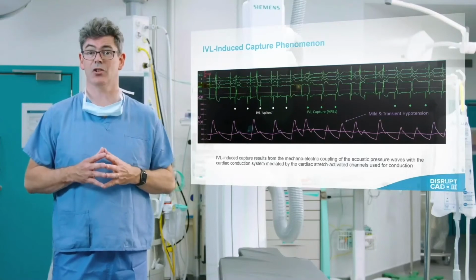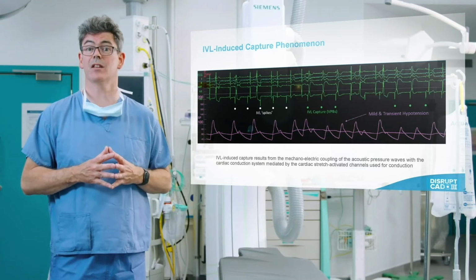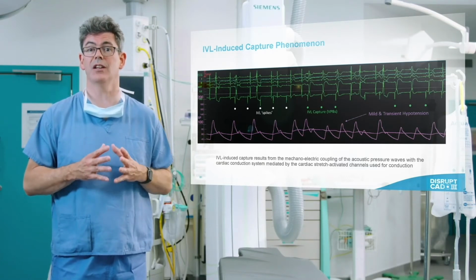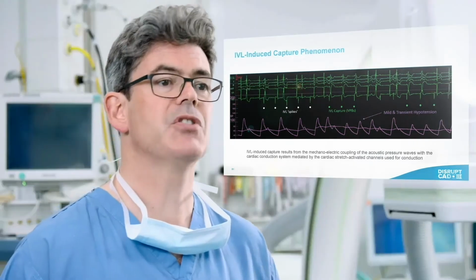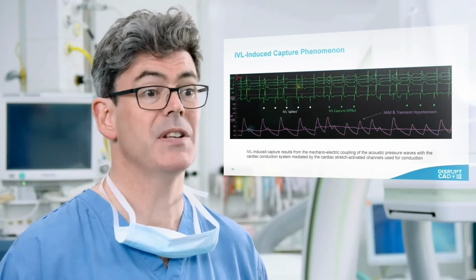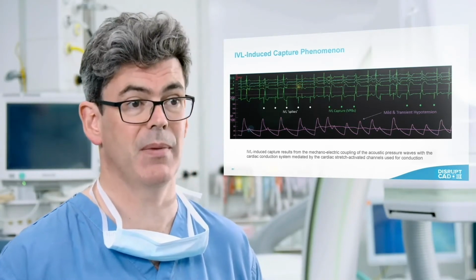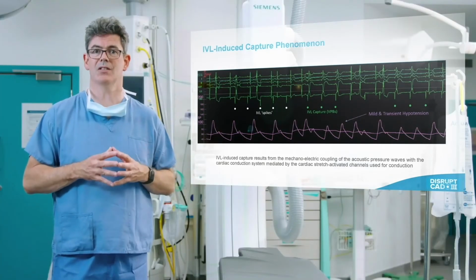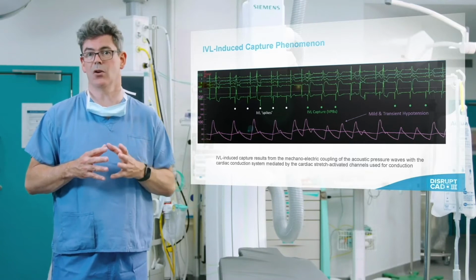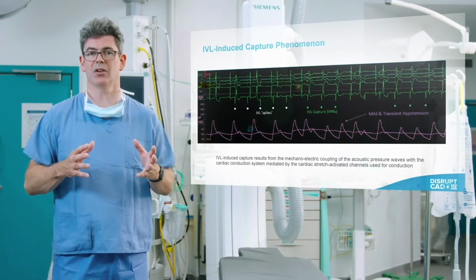IVL ventricular capture has been noted before this study, and this study demonstrates that 41% of patients had some evidence of IVL-induced capture. It was significantly more common if the pre-procedure heart rate was lower, particularly by multivariate analysis less than 60 beats per minute. The drop in systolic blood pressure was more frequent but, as you can see, not more severe based on this analysis. And there were no significant sequelae.